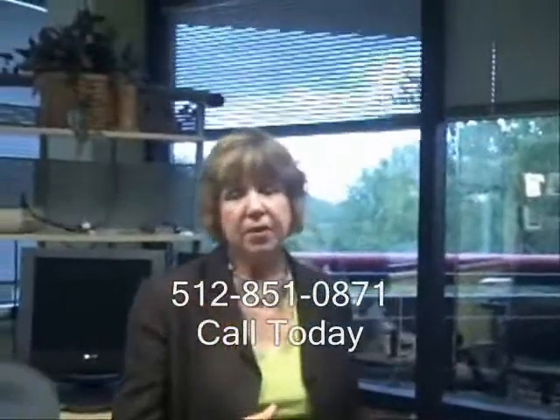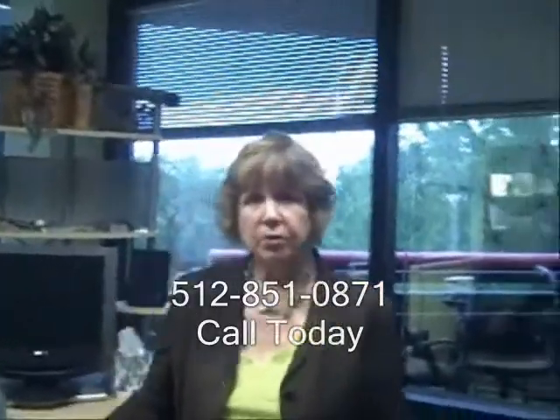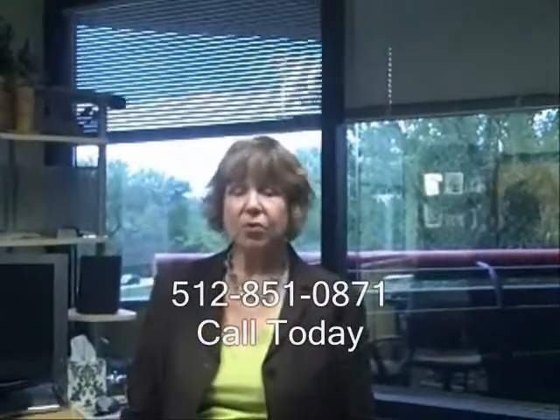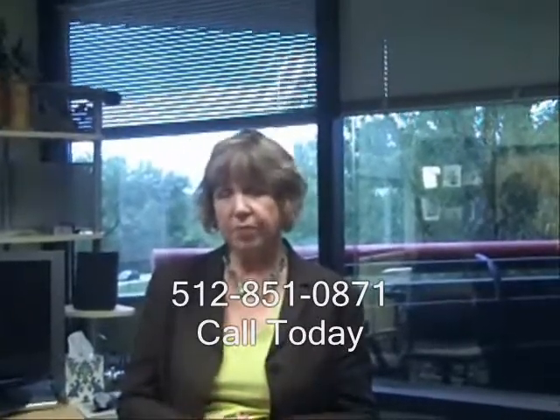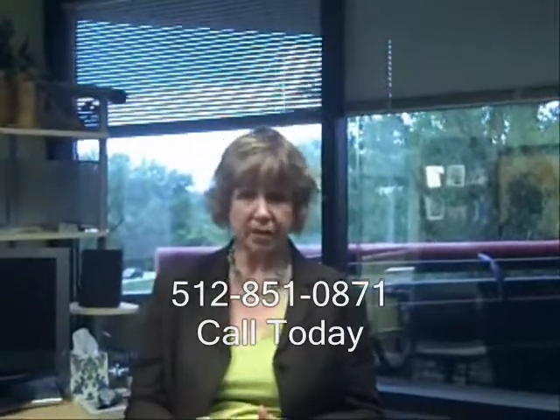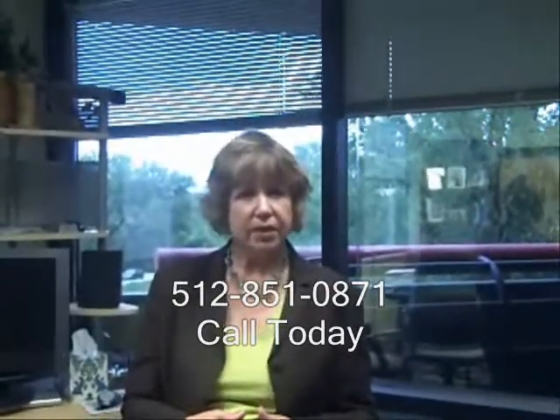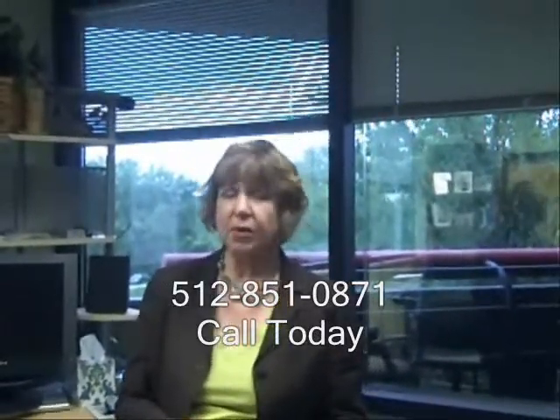Okay, after the booth, this booth is part of a local network, and it exports your hearing test over here to a bigger screen where we can sit and talk about your hearing test. Now, if you have a big enough hearing loss, sometimes I have a lot of demonstrator hearing aids. I program those, and then we talk about your hearing loss so that you can hear me clearly. I really want you to have no loose ends and be really sure about what we've talked about. I don't want you to have to guess about anything.